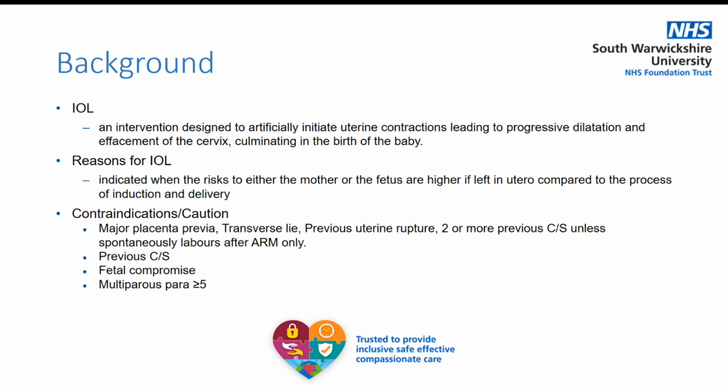So as we all know, induction is an intervention where we're trying to encourage labour, culminating in the birth of baby. And this is through progressive dilatation of the cervix and initiation of uterine contractions. We do induction for a variety of reasons when the risks for either the mother or the fetus are higher if the baby is left in utero compared to the process of induction and delivery.